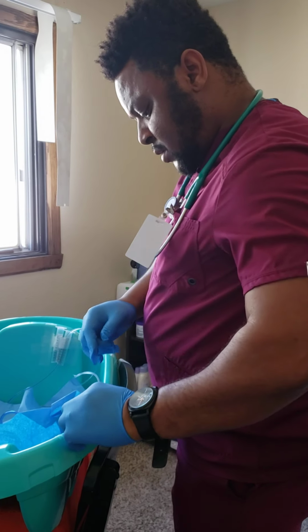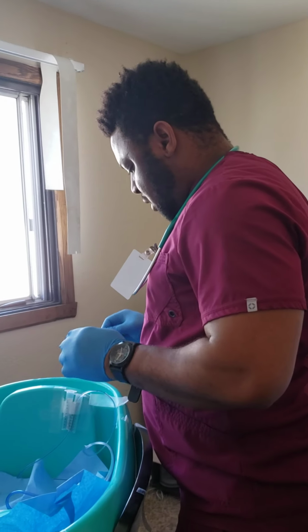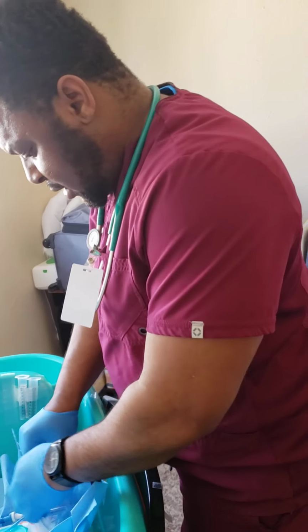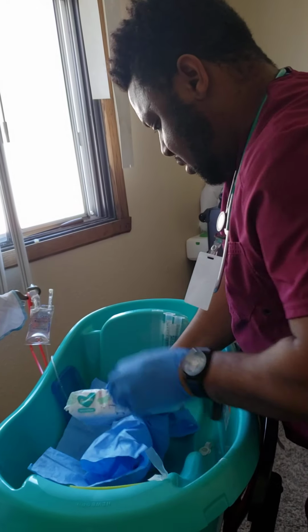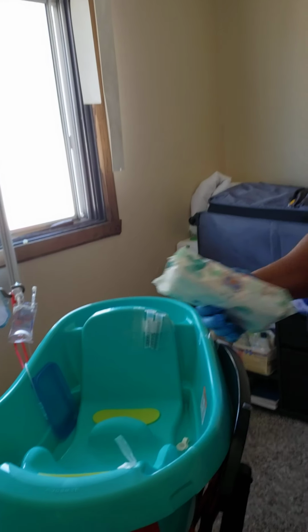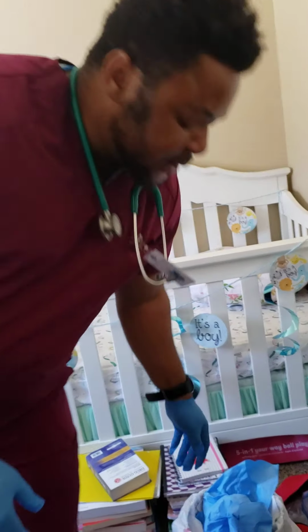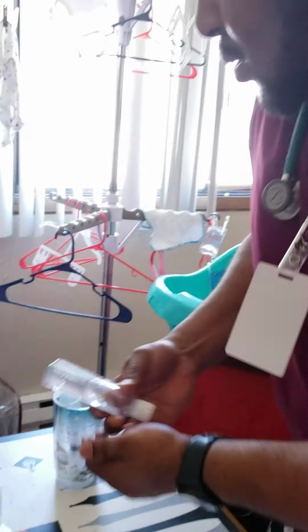After that has been done, I'll then tell the patient, okay, I'll go ahead and count 1, 2, 3. As they take a breath, I'll go ahead and pull it really fast and then wrap it in the paper towel here. I wrap it, take it off and give my patient their paper towel to clean their nose. So I'll go ahead and take my gloves off and wash my hands. Then I'll reassess my patient.